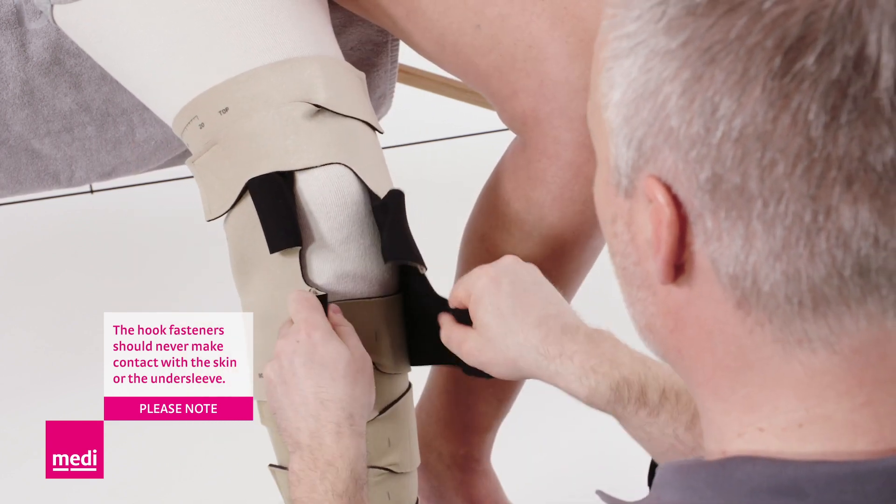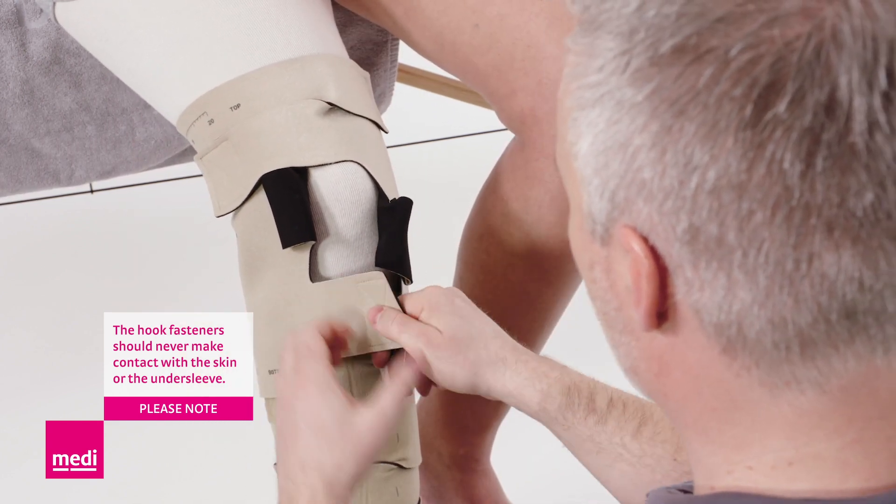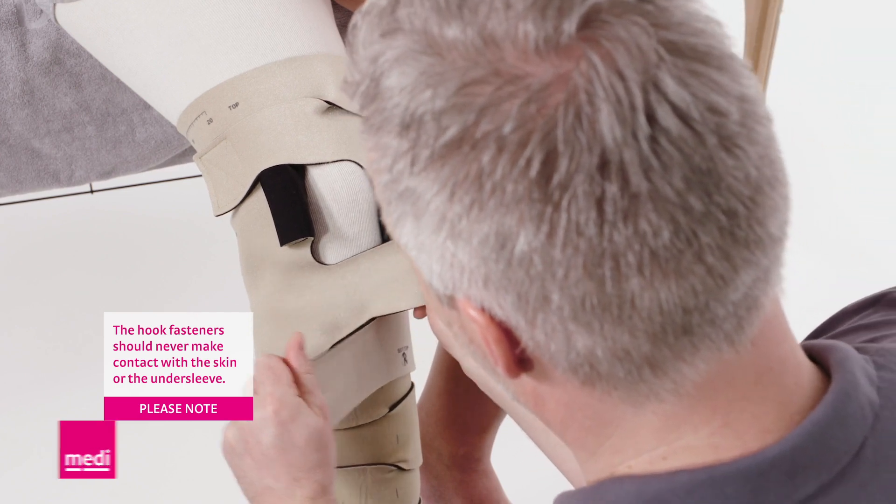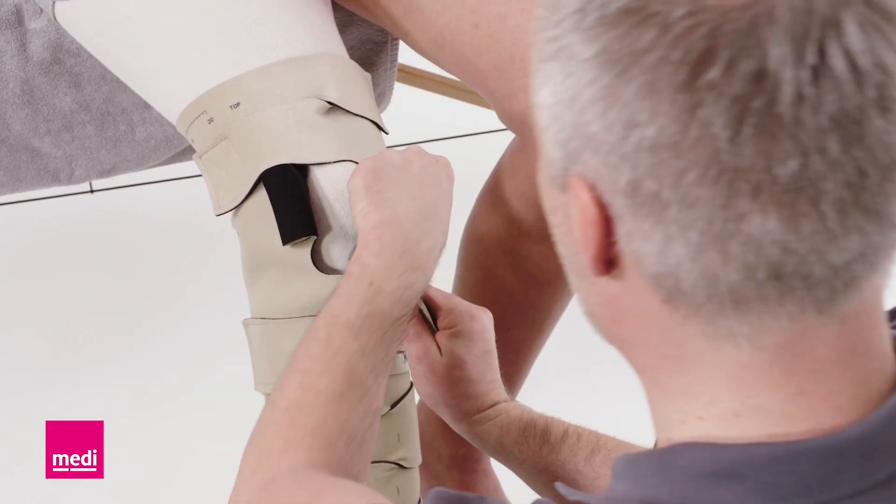The knee component should overlap with the lower leg garment. Attach the bottommost band with firm and comfortable tension.